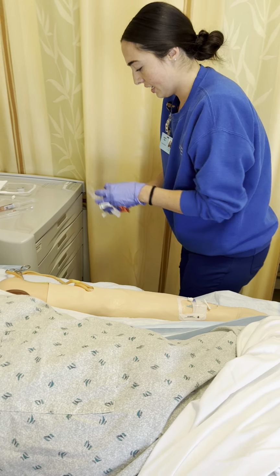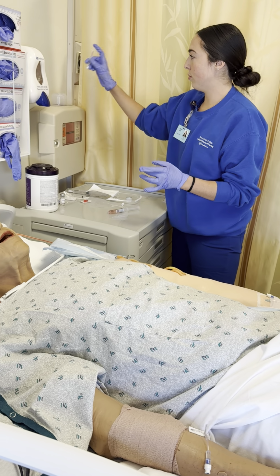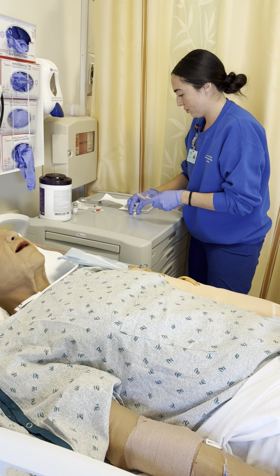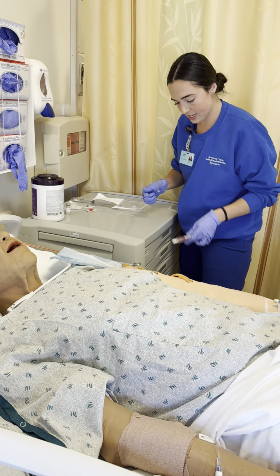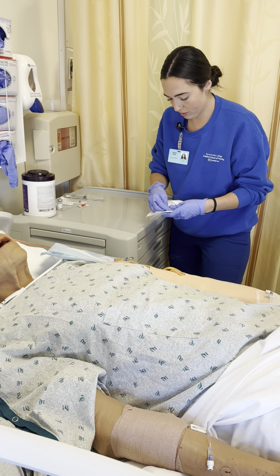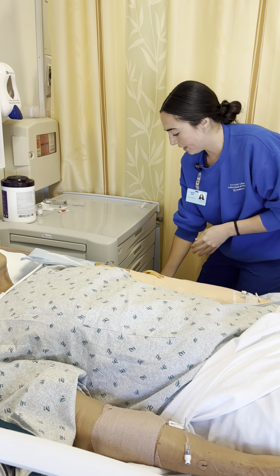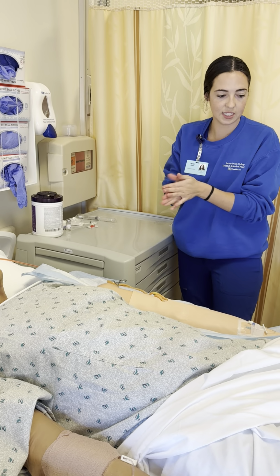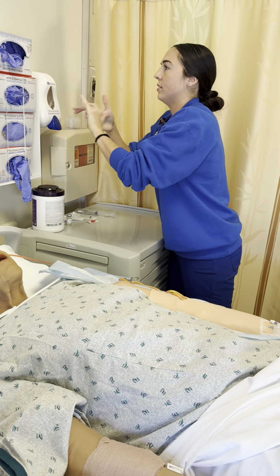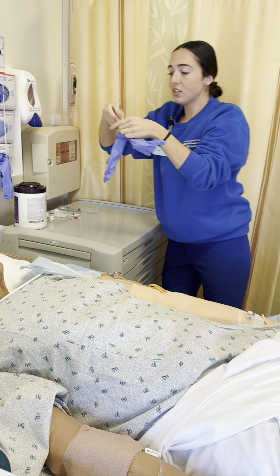So everything in here is trash. I no longer need it. I'm going to throw the old needle into the sharps. Throw this into the trash. It's not needed anymore. All of this can be thrown in the trash. And I'm going to go ahead and remove my gloves and sanitize. All right. Throw my gloves. So I've done my hand hygiene.